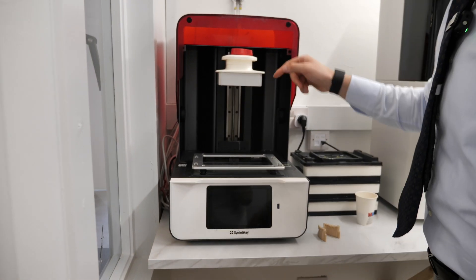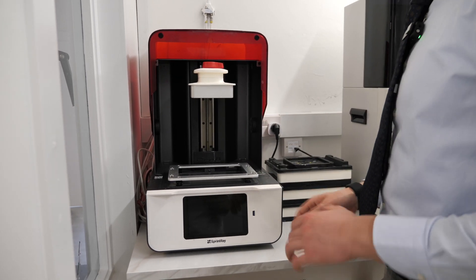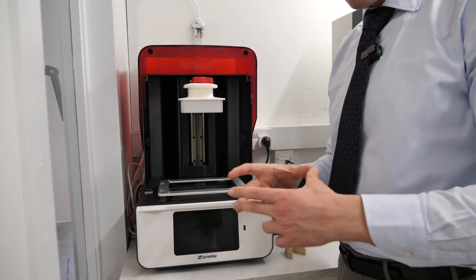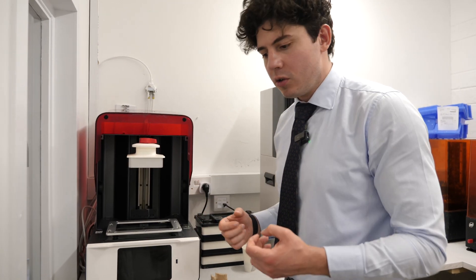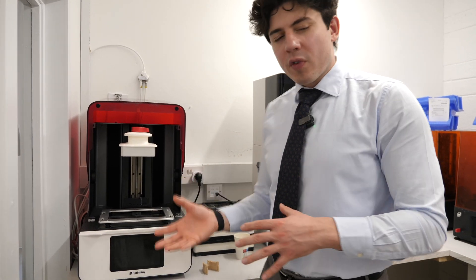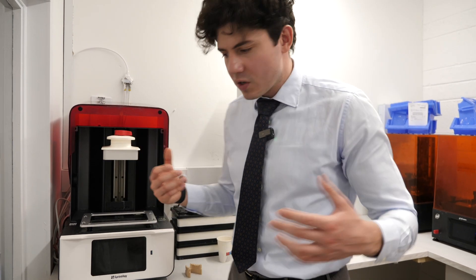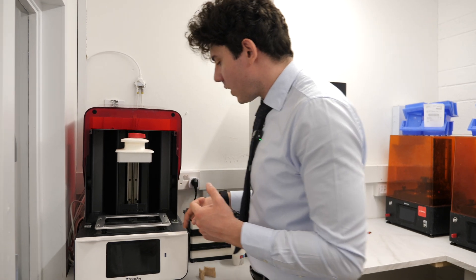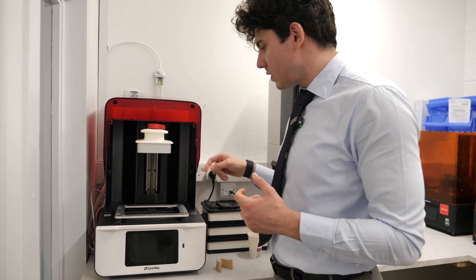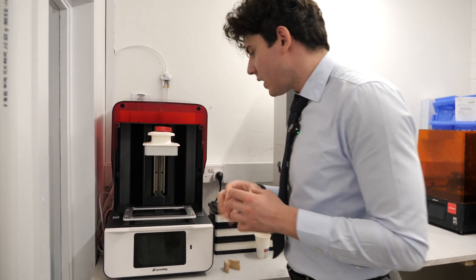The build plate determines the size of model we can print. We don't use the 95S because 95 microns in the XY axis means lower resolution — the only advantage is a bigger build plate allowing more models. We've overcome that by using higher-resolution printers with bigger build plates, so there's no logical reason to use the 95S. The 55S is 55 microns.